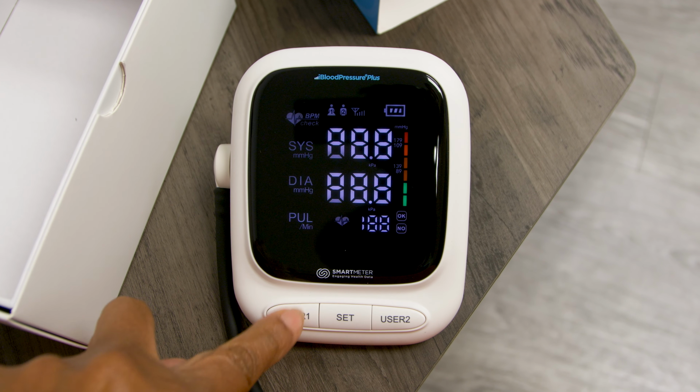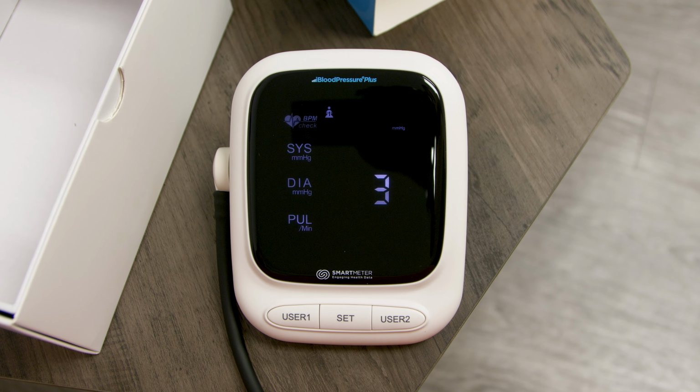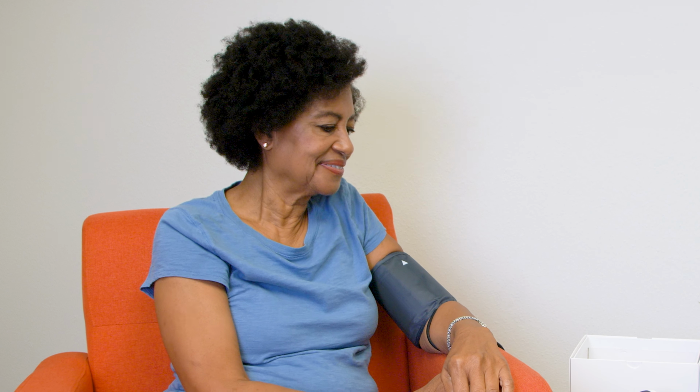Now, press your assigned user button. Your iBloodPressure Plus will turn on and automatically start the measurement process by smoothly inflating the cuff. The voice assist feature will start giving you guidance on taking your blood pressure.